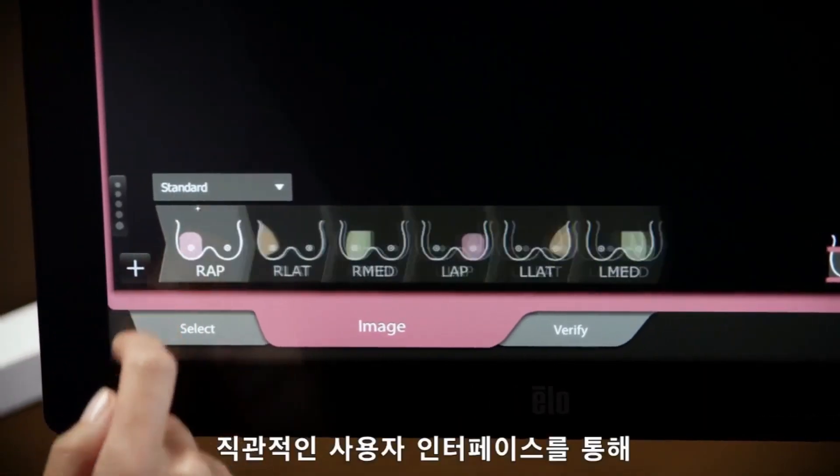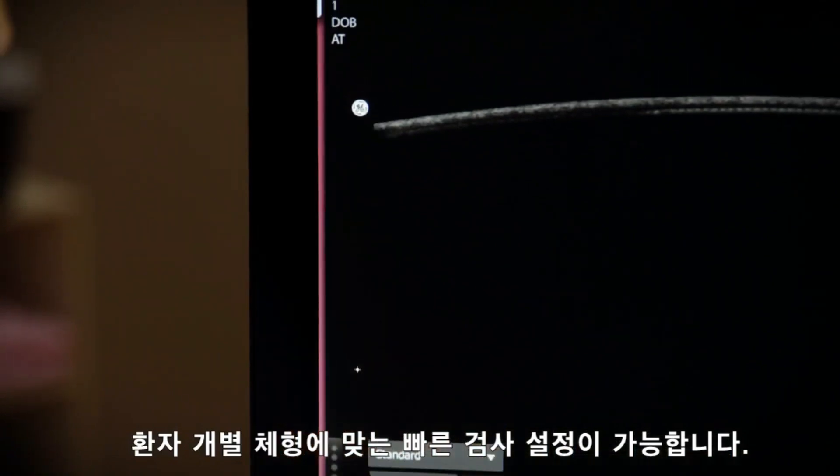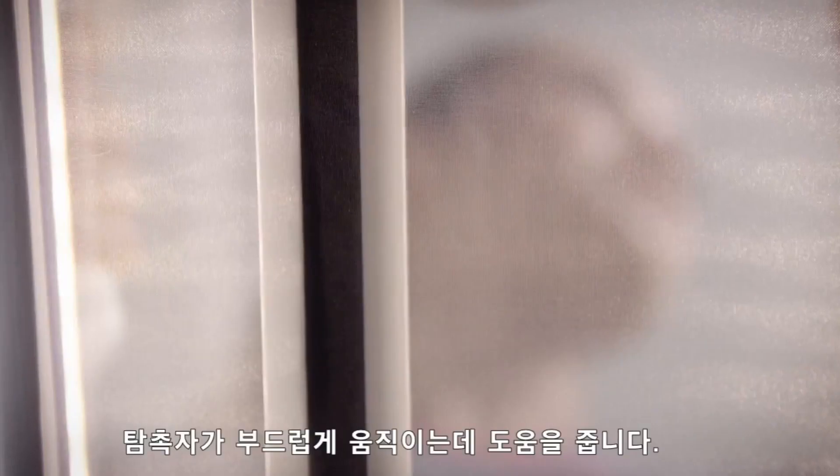The exam begins by selecting the patient information from a work list or entering it manually. A disposable single-use mesh membrane is used to aid in acoustic coupling, compression, and stabilization.